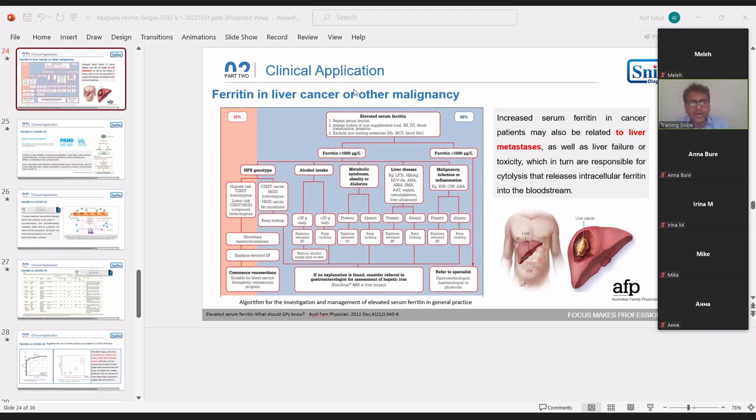But if unused reagent is kept on board, the reagent stability is practically 2 months or 3 months. But the package insert recommends that you finish the reagent within 1 month. Otherwise, you may need a repeat calibration, QC frequency may increase, or the reagent performance may be compromised.